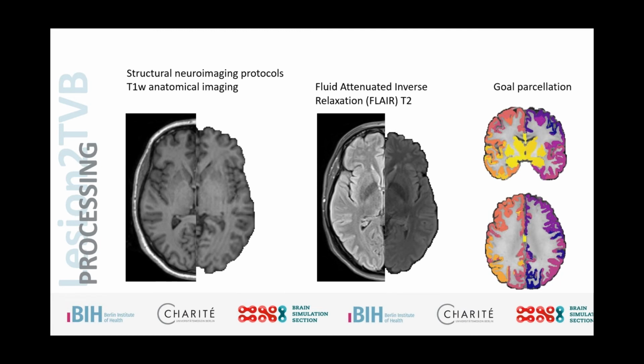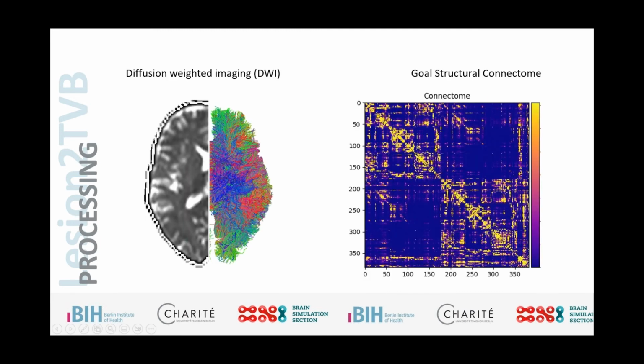The other main data acquisition technique that we have is the diffusion weighted imaging, where the focus in the acquisition, the physics actually of the acquisition, has a little bit of a different focus. Now we're trying to capture, instead of the actual intensity at the voxel, we're trying to capture and then extract the pathways of the brain. So here we're talking about the white matter tracks that we want to extract to get these nice little colorful images of the tracks that are actually going through the brain.